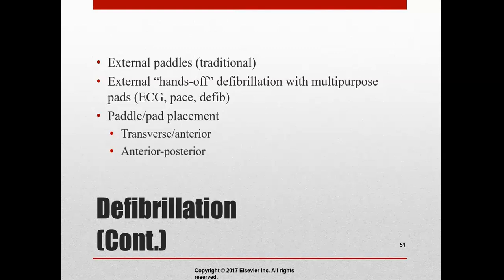So external paddles are that traditional way of doing it. We also have the external hands-off defibrillation with multi-purpose pads. These are really the ones that are most commonly used nowadays. And then we have paddle and pad placement. So it's transverse anterior and then anterior posterior.